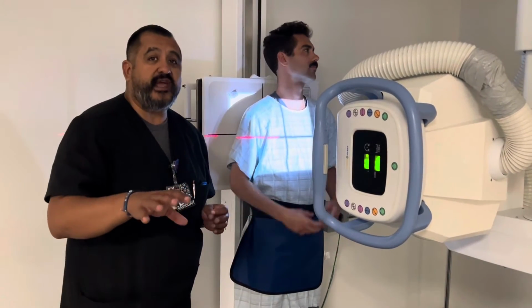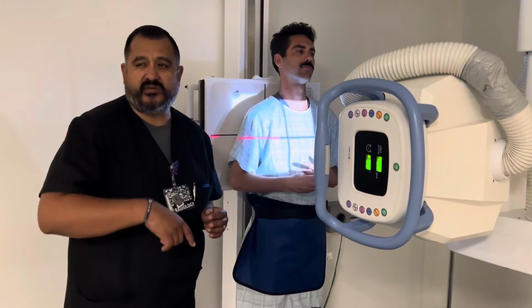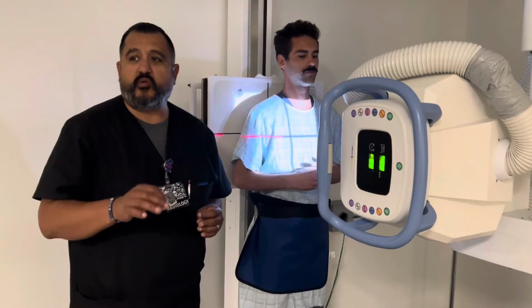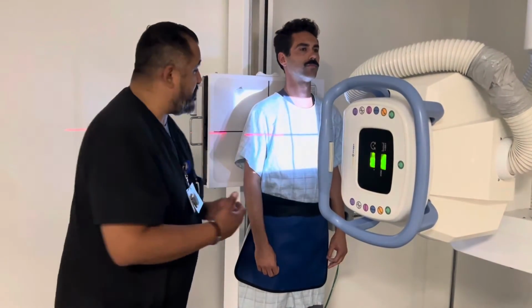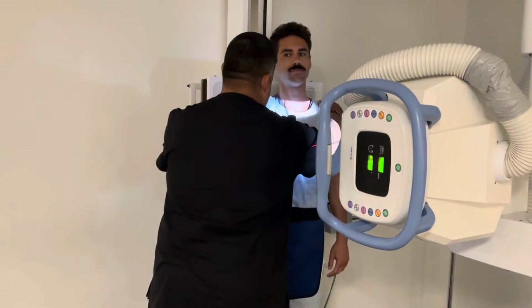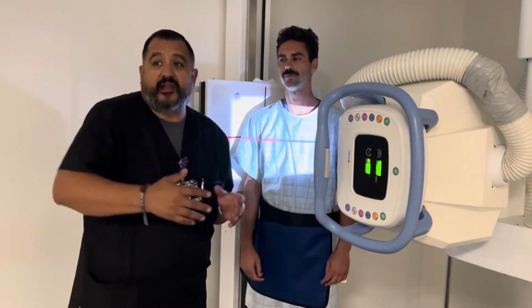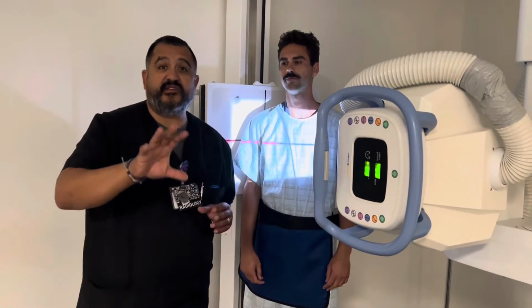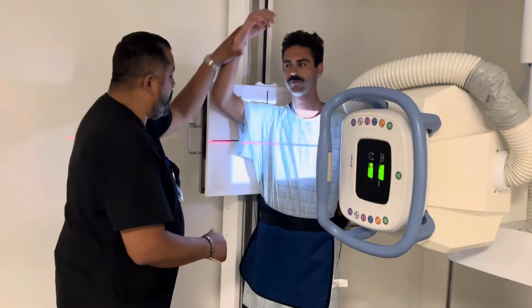So in the field, we have the obliques. We have a term for the obliques, and we say post is close. So if he has a posterior rib injury, you want to turn to where the site of entry is closest to the IR. So we're going to do an RPO, just like this here. Now, which arm do you get out of the way? Whatever the site of interest is, that's the arm that you have to bring up. So we're going to bring this arm up, right?